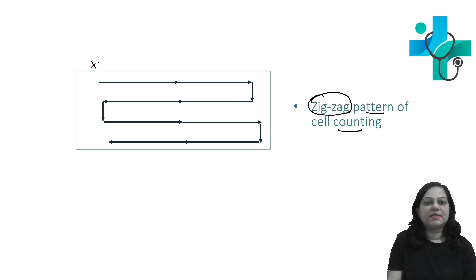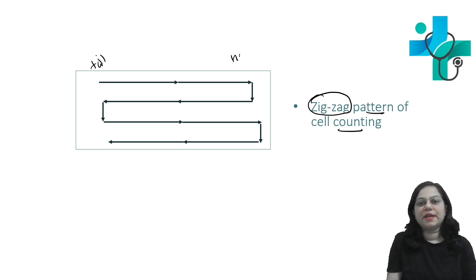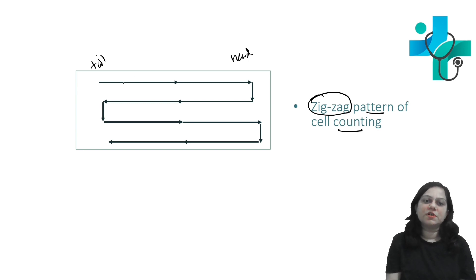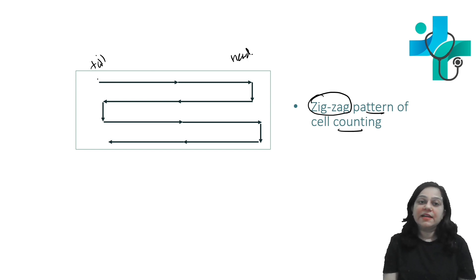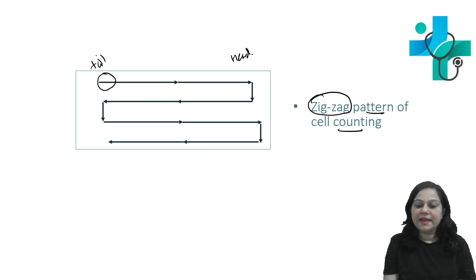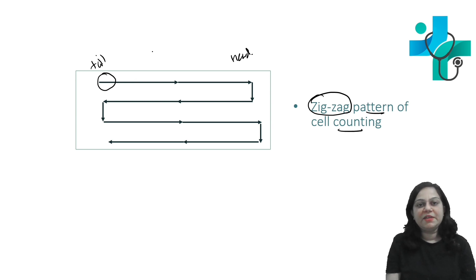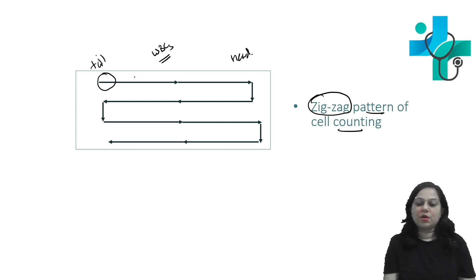This is the tail end of the smear and this is the head end of the smear. Select the area from the tail end of the smear and identify different white blood cells.